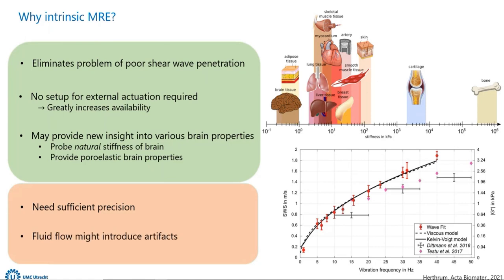And a problem that we run into is that fluid flows within the brain, such as from CSF motion or larger blood vessels, may introduce some artifacts that I'll show in a minute.